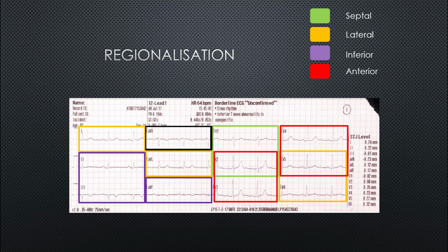The king in any pattern recognition of cardiac injury is regionalization. And the rule of thumb is to base the reading of the ECG on the regional distribution of the leads around the heart. In other words, we read the ECG utilizing the lead groups rather than any particular layout on the ECG printout itself. The recognition of the signs of acute myocardial infarction and the acute cardiac syndromes rely on one or more contiguous leads showing signs. So the lead group approach is the strategy we use to maximize recognizing whether the specific rules that we have to rule these conditions in are met or not.